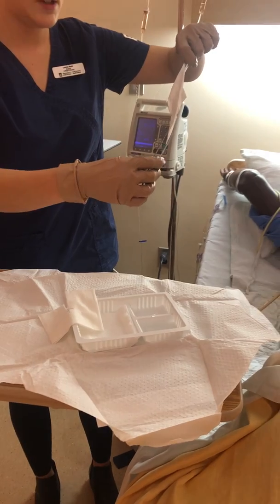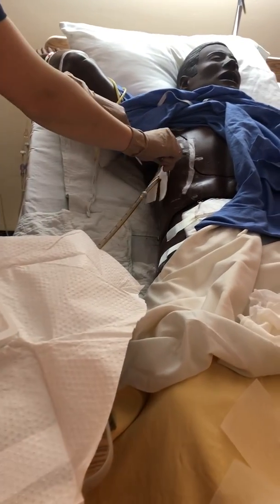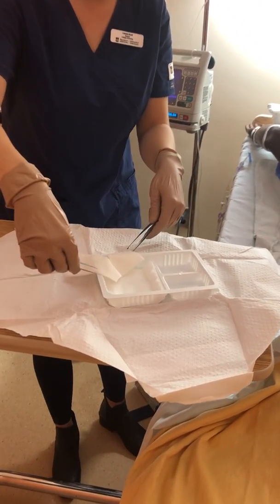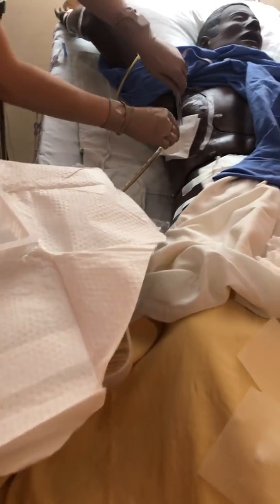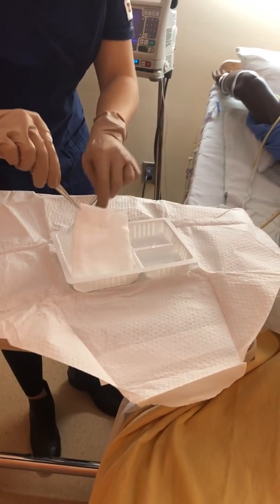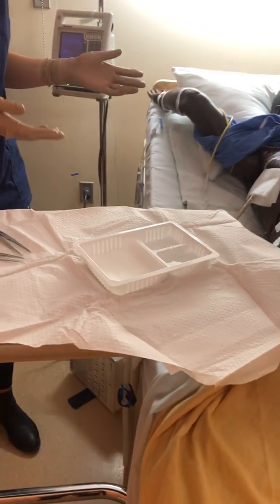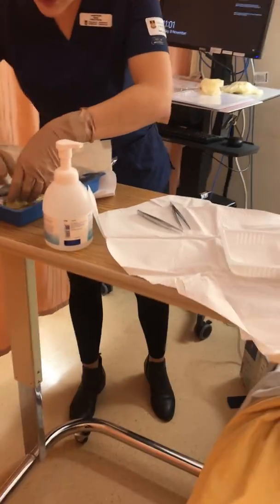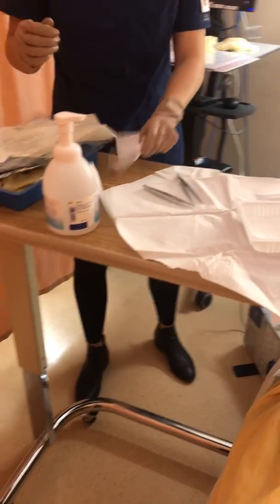So I'm going to take my drain sponge here and put it around like that. I'm going to take my second one here and put it in an opposite direction here. Good. I'm going to take this sterile 4x4. Okay. And just place that on top. Okay. So now we no longer have to be sterile. That's all occluded.